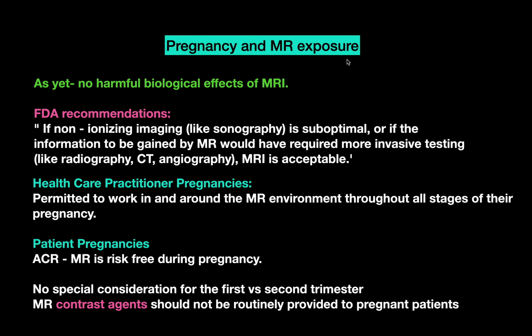Now, pregnancy and MRI exposure. As of now, there are no harmful biological effects of MRI in pregnancy. But the FDA recommends that if non-ionizing imaging like sonography is suboptimal, or if the information to be gained by MR would otherwise require more invasive testing like radiography, CT or angiography, MRI is acceptable. Healthcare practitioners who are pregnant are permitted to work in and around the MR environment throughout all stages of their pregnancy.